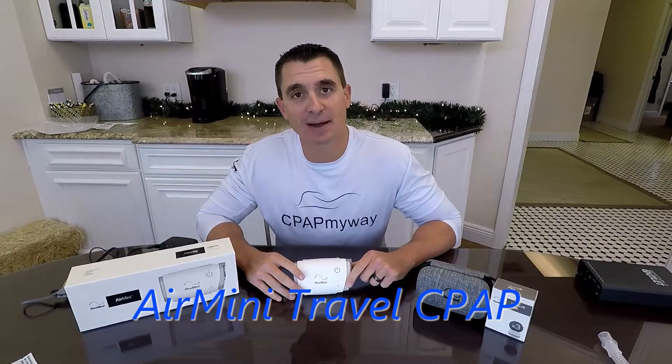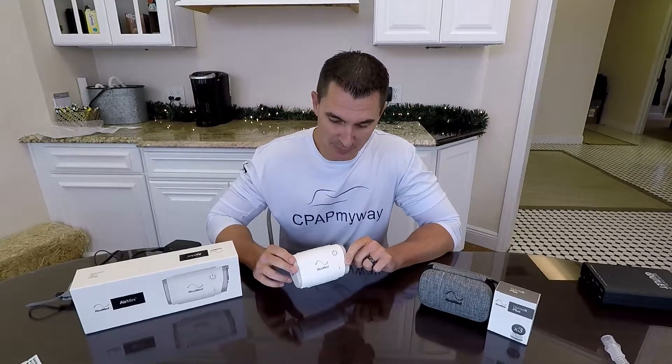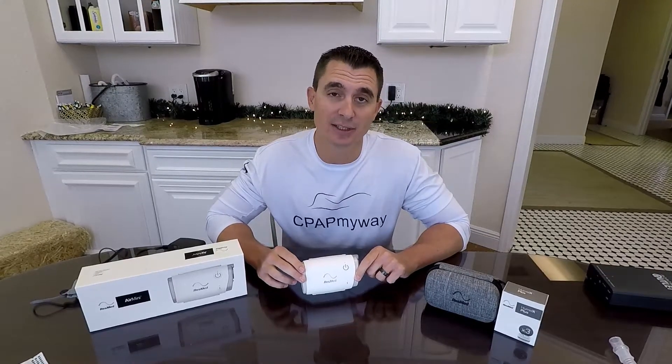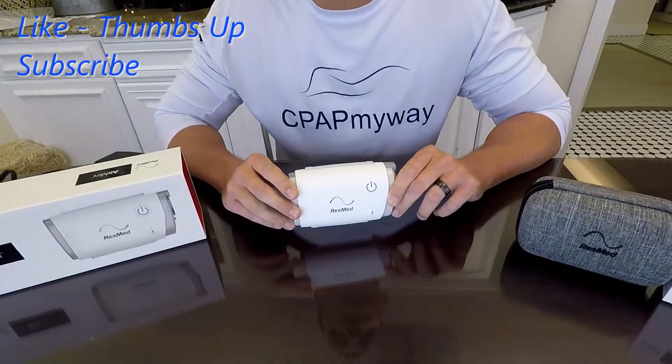Hey, this is Clay, CPAP MyWay, CPAPMyWay.com. Today we're going to talk to you a little bit about the Air Mini, a long overdue video for us to be honest. The Air Mini from ResMed has been out for about three years now and it's by far the smallest travel CPAP on the market. We wanted to go over some basic operation as well as some pros and cons, our personal review, and some tips and tricks about buying and using it. Enjoy the video.